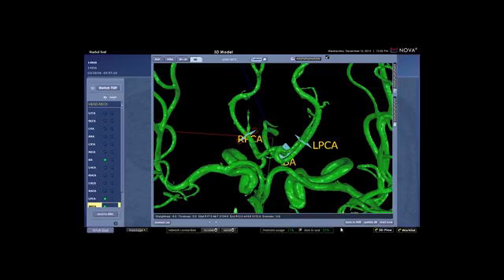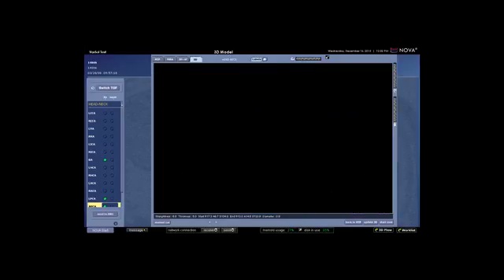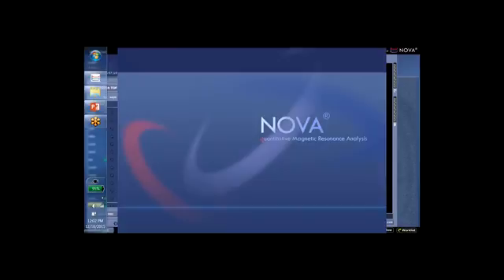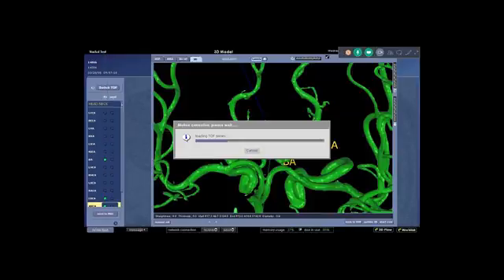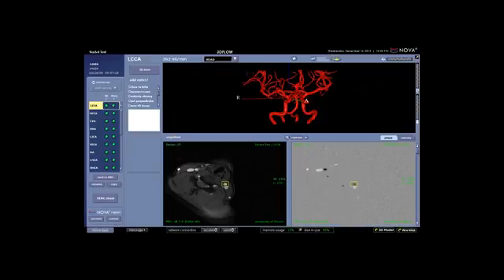They take about 30 seconds to run, so I can now switch over to 3D Flow, the other part of Nova, and start to look at the results. So a 3-vessel scan like a Veritas protocol will be less than 5 minutes additional time. Nova gives the option to measure as many vessels of interest as the physician would like to see. The additional time is going to be proportional to the number of vessels studied. If 5 or 7 vessels are requested, that's going to add about 5 minutes to the protocol, and so on. Okay, so here are measurements that have come back.